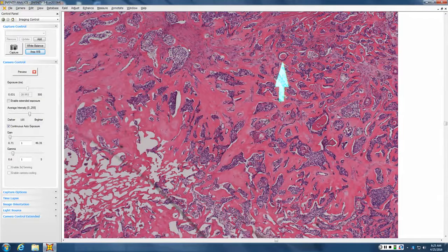What's a sweaty tumor with an osteoid-like stroma? A lot of times you have a mixed tumor that has cartilaginous stroma, but I haven't seen bone. Any fellows want to weigh in? Chondroid syringoma, or chondroid sarcoma? But if this is not actually bone, that's a million layers of basement membrane zone forming that osteoid. Just acrospiroma, benign poroma.